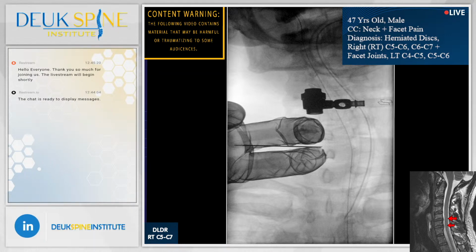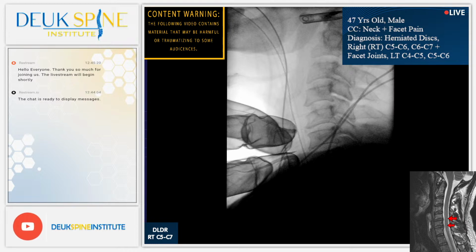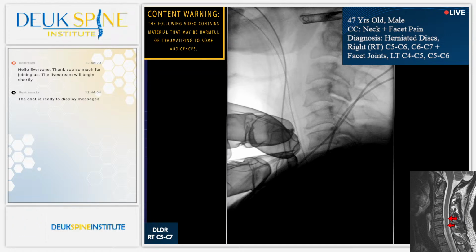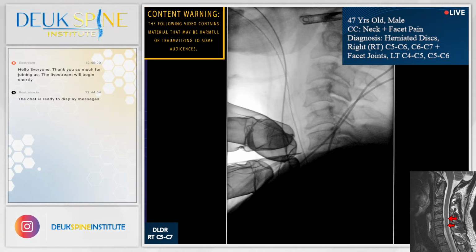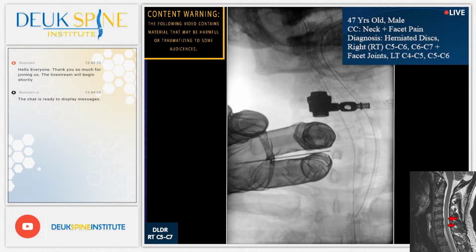The key to this surgery is 2, 3, 4, 5, 6, 7. Everybody agree 6, 7? Yes? Shot? Yep. I'm going to move down. 2, 3, 4, 5, 6, 7. All right. Shot? It's a little lower than I want to be. Shot? Let's get a quick AP. Shot. Perfect. Lateral.